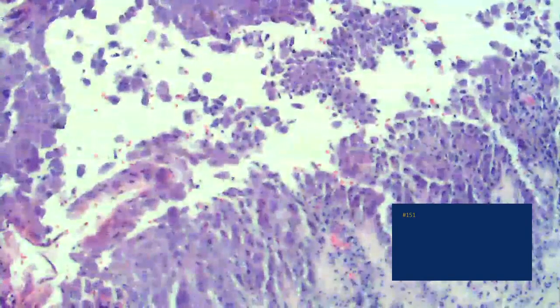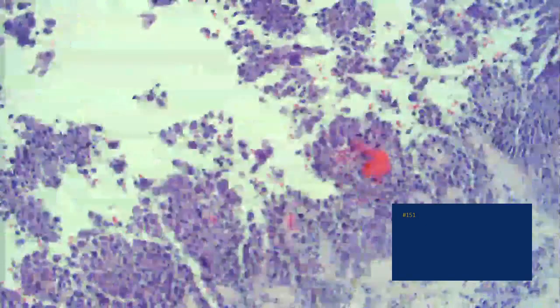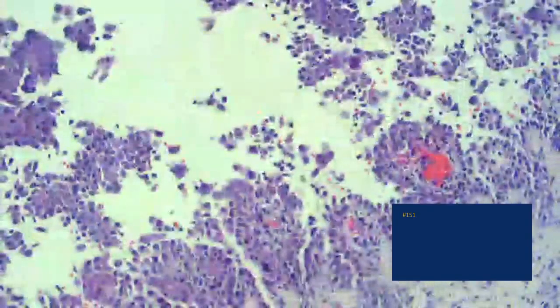I'd say, you read the textbooks and they talk about dilapidated brick wall or Hailey-Hailey disease and all this kind of stuff, and if you just had this area, that could be somewhat difficult to distinguish from Pemphigus vulgaris here. So a good teaching point is that sometimes in PV you get acantholysis throughout the epithelium, and if you look to the side, you see this change, that's almost never seen in Hailey-Hailey. So this you don't ever get in Hailey-Hailey, but this you can get in Pemphigus vulgaris.